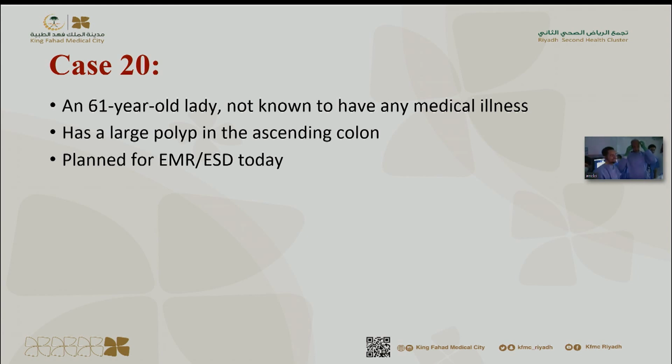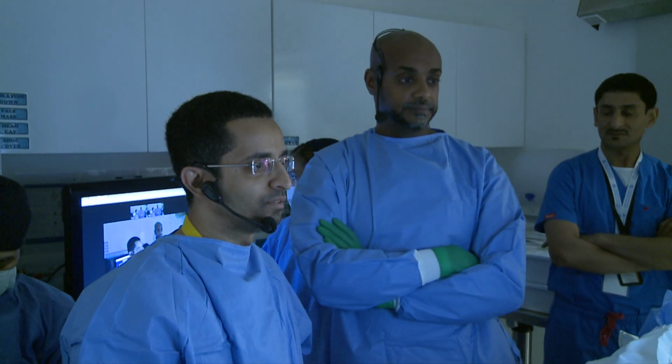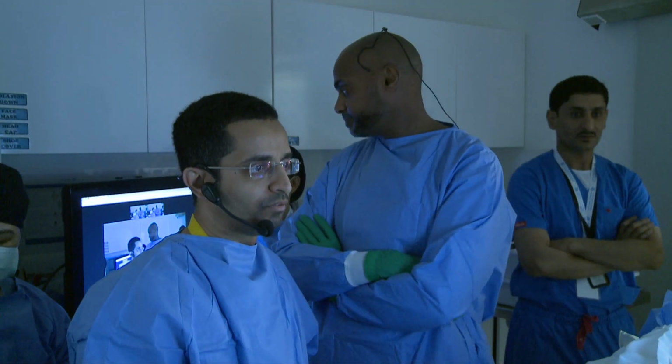She has a large polyp in the ascending colon. Hello, do you hear me? Planned for EMR/ESD today. Hello, do you hear us? Yes, we can hear you, Dr. Majid, Dr. Ammar. Okay, thank you.